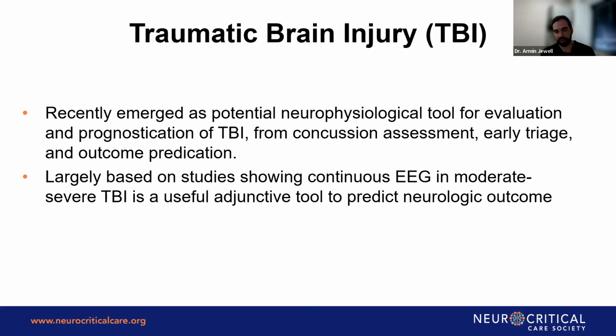And so if that is the case, then potentially there's a couple of thoughts: they can use it as an initial TBI assessment tool or from an outcome prediction standpoint.